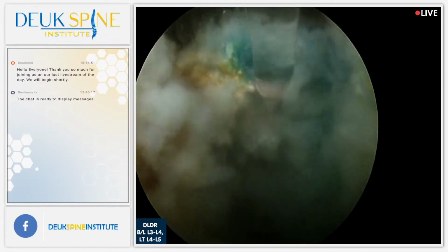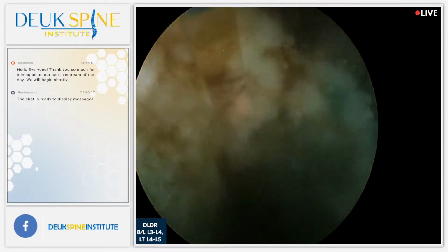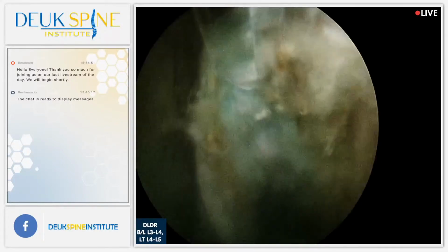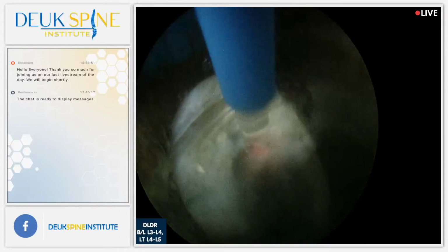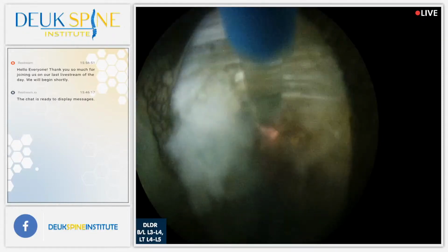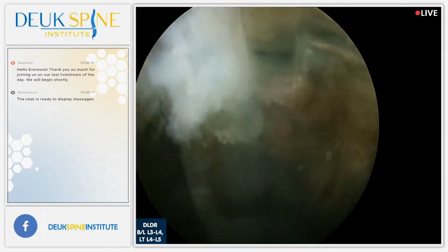I think the x-ray would be fine because I'm aiming for a different target than him. He's aiming for the muscle belly. I'm aiming for where the attachment of the muscle is to the femur. So it's more of a tendon release, whereas he's doing more of a muscle injection. And then Davis will do it as well, I'm sure. I teach Patel. He'll do it if he wants.